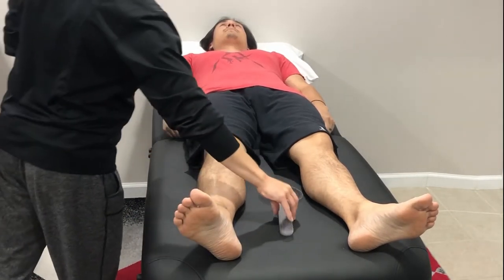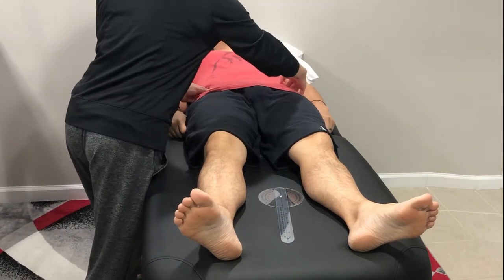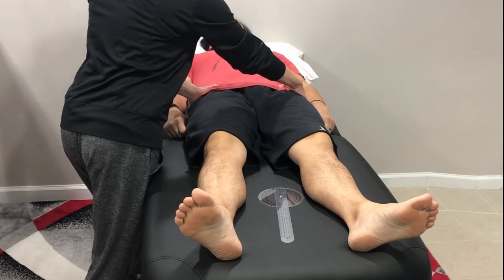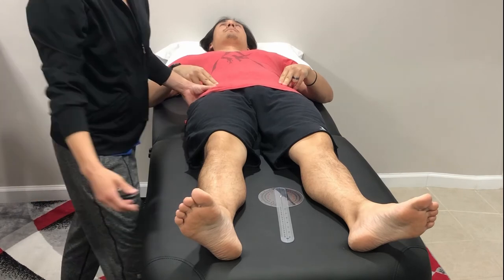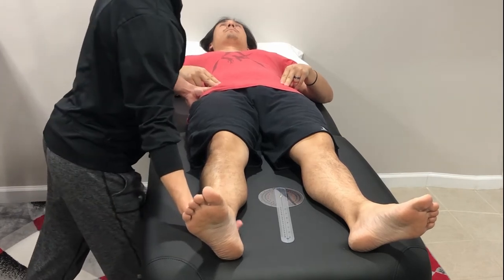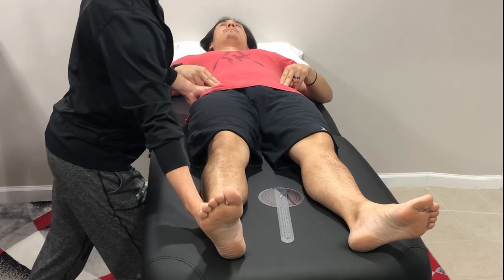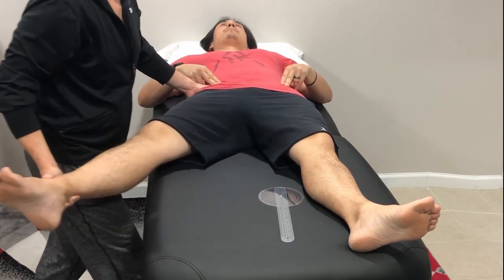Measuring abduction of the hip, coming in, finding my landmarks, palpating the iliac crest and the ASIS. Would you go ahead and use your fingers to mark that for me? Thank you. I'm going to check passive range of motion, blocking the iliac crest, stabilizing under the ankle, keeping the leg in neutral rotation, and abducting, looking for end feel.